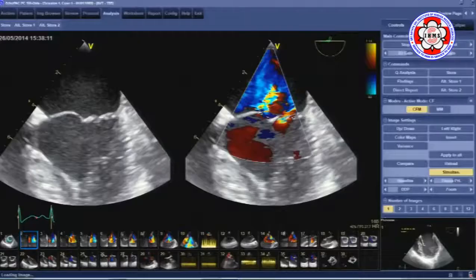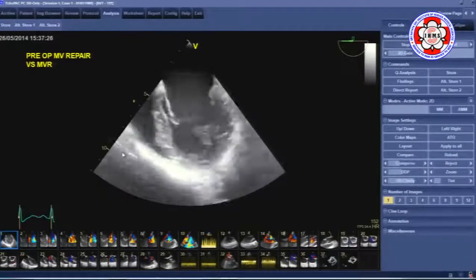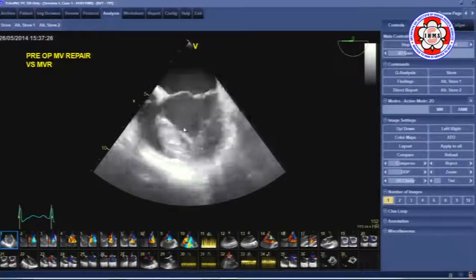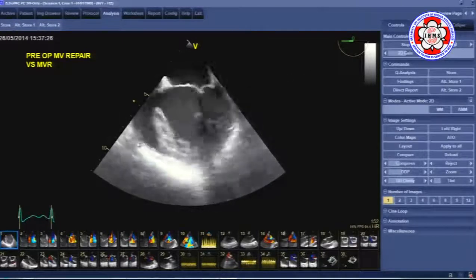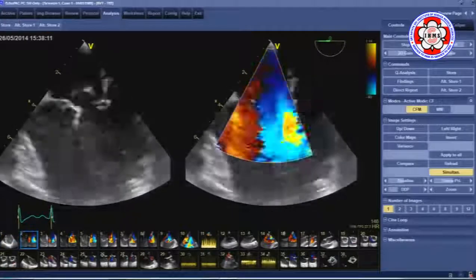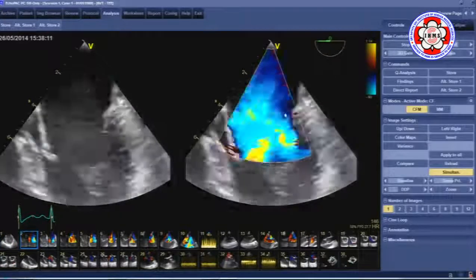So you were expected to say that on the mid-esophageal 0-degree view, you're seeing the A2. This is the mid-esophageal 4-chamber view, right? So this is 0 degrees. We've just put the probe in the heart. You can see that the patient is a bit tachycardic, so I'm going to slow down the images to make it easier to see. And then when we focus on the mitral valve, you can see on the color display that there's quite a bit of mitral regurgitation.